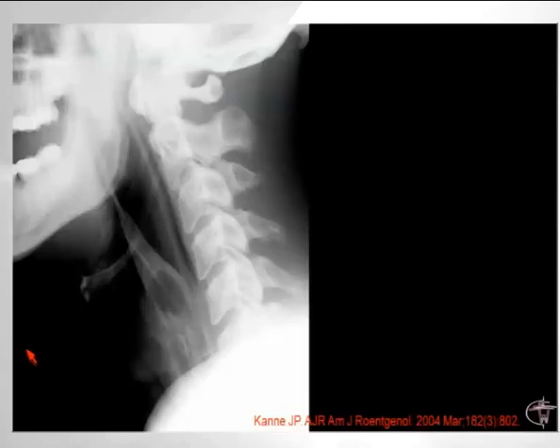And then there's the unusual presentation of the fish. This gentleman came to our emergency department with stridor and respiratory distress because he had tried to swallow a whole live fish.